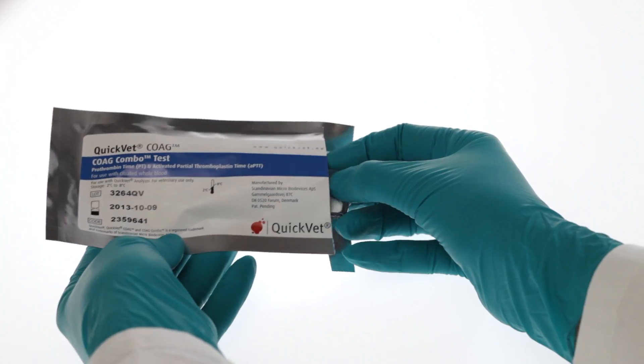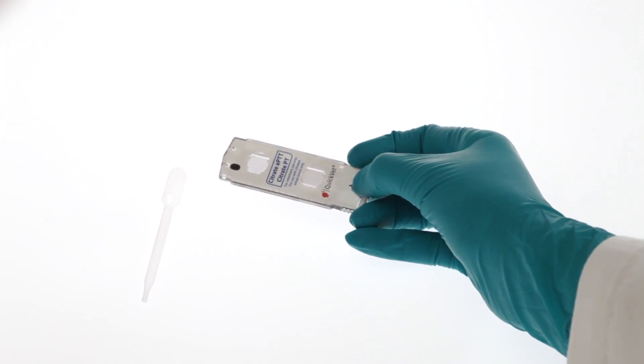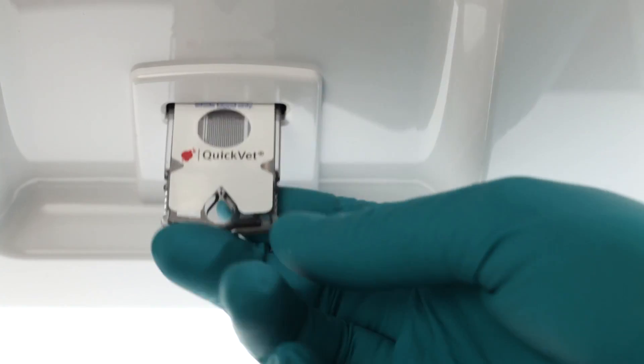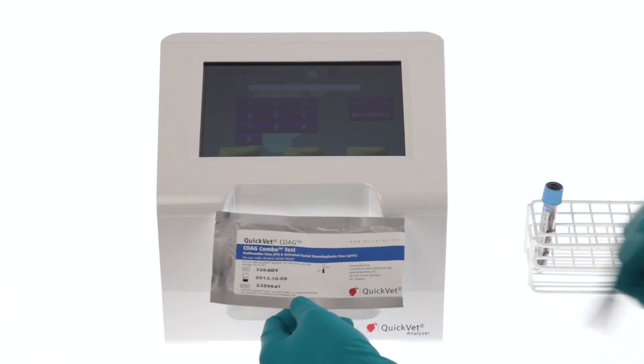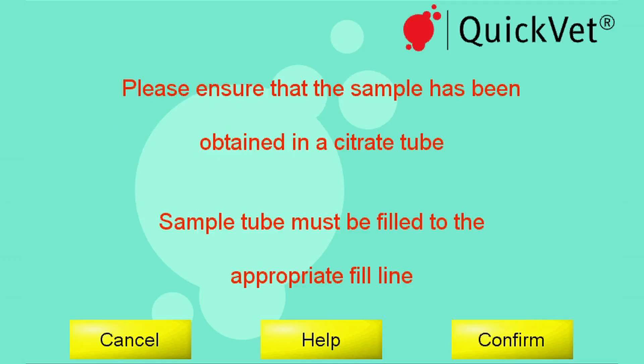To start testing, push this button. The coagulation test pouch contains a cartridge and a pipette. When prompted for the cartridge code, type the code found on the front of the cartridge pouch. You will be reminded that you should use whole blood collected in a citrate tube.